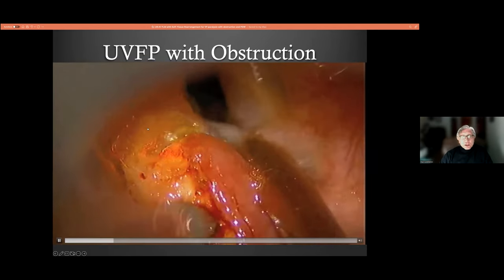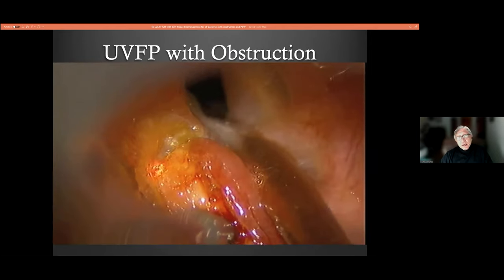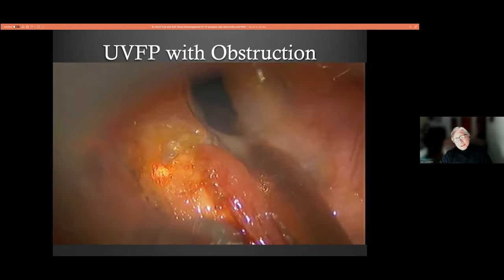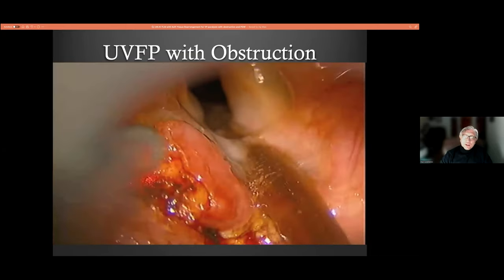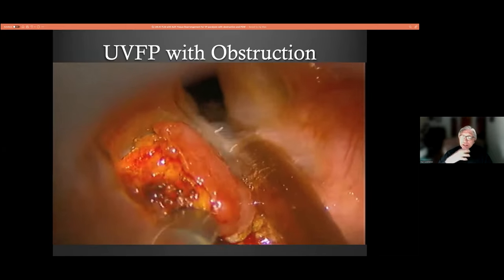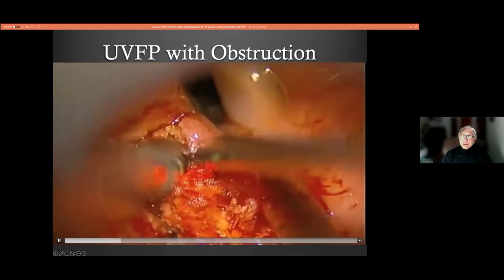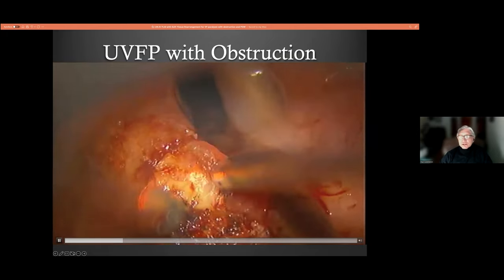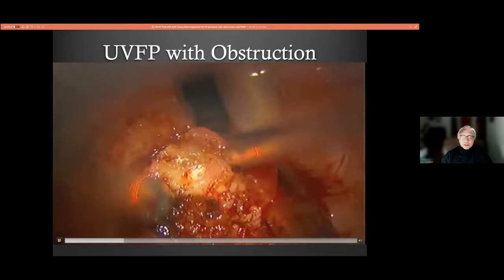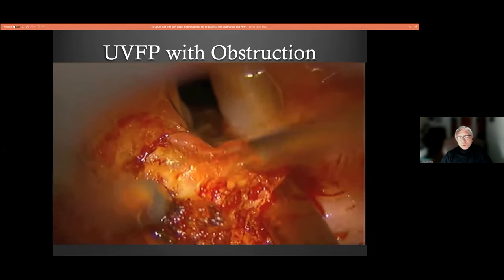So here's the cartilage that has become hypertrophic just out of its malposition. For some reason it changes in character post-paralysis, it just seems to flop in the way. The tissue on the opposite side of the larynx is quite normal in appearance, but this is certainly an excessive amount of cartilage. So I'm endeavoring to remove it and preserve the mucosa.